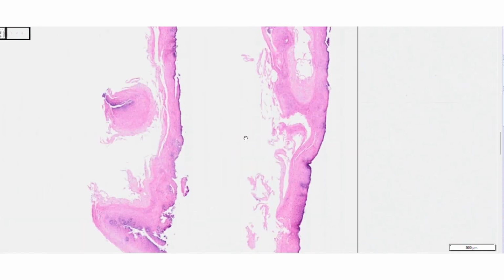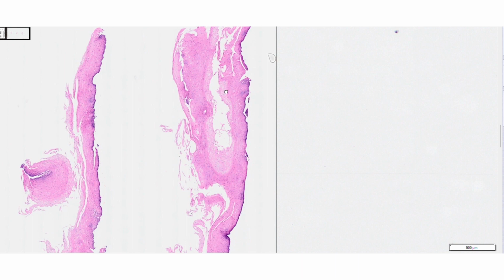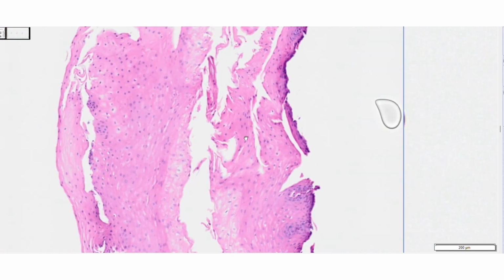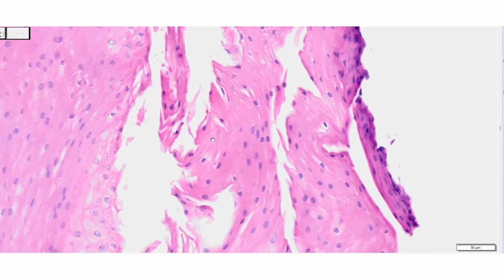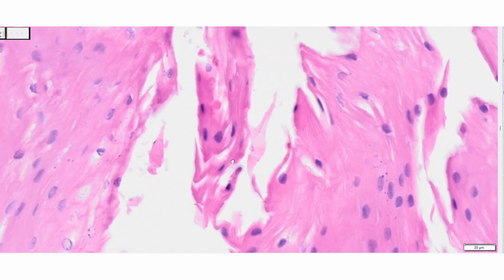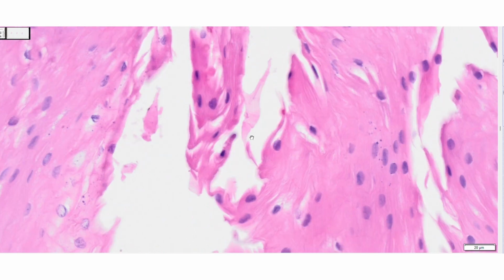Another pretty important finding here to show you. This is the mid-esophagus, and these are flukes. This one you can see, this is the ventral sucker or acetabulum, and it is used to attach itself to tissue. And up here, this will be the oral sucker.